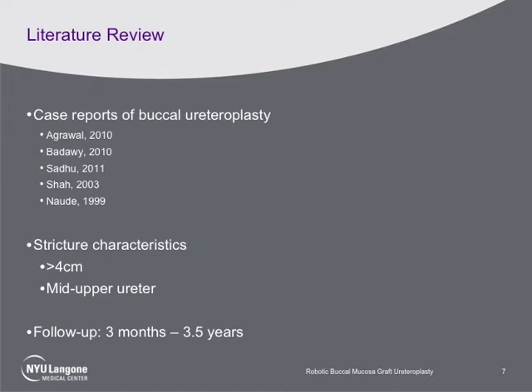This novel technique applies buccal mucosa graft, which is widely used for surgical management of urethral strictures. A review of the current literature on this new reconstructive technique yields several case reports of an open procedure with promising results in terms of procedure success and morbidity. We now apply a minimally invasive approach with robotic assistance to this new procedure.